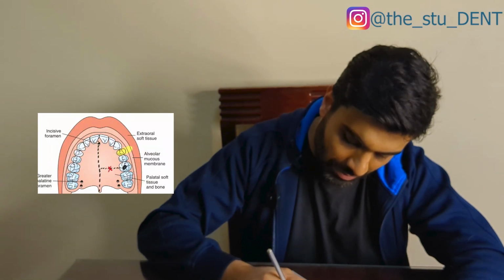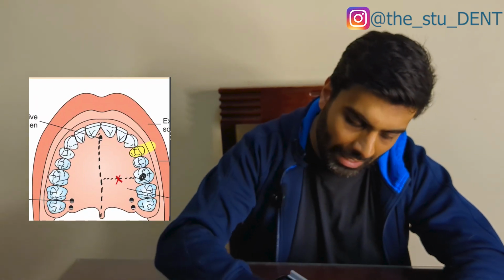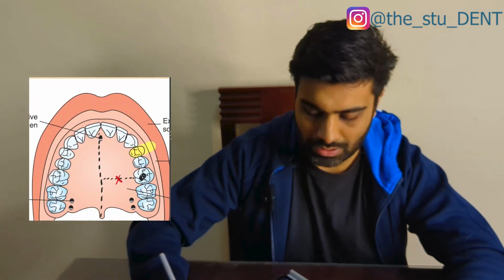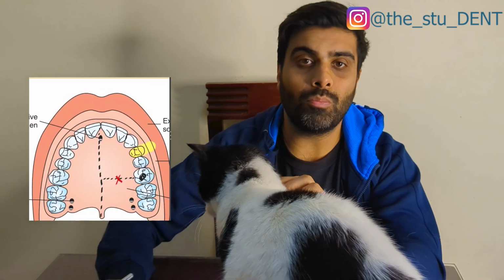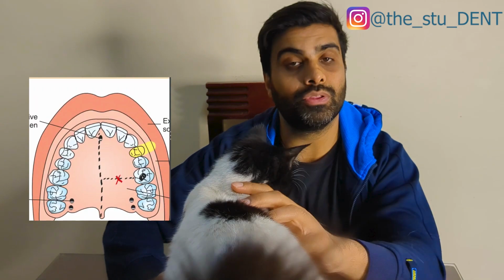So if I can find it on this picture here, we'll just ignore the examples for now. If we were going to work on this tooth here, for example, which is the upper left 6, I believe. This is the cervical region of the tooth. We want to be heading out towards the midline of the palate. Okay, that's the midline of the palate right there. And X marks the spot. I'll make it in red. We want to be about halfway through. Now, as you remember, we used 1.5 for that buccal infiltration, and it leaves us now for the palatal side of things with 0.3.